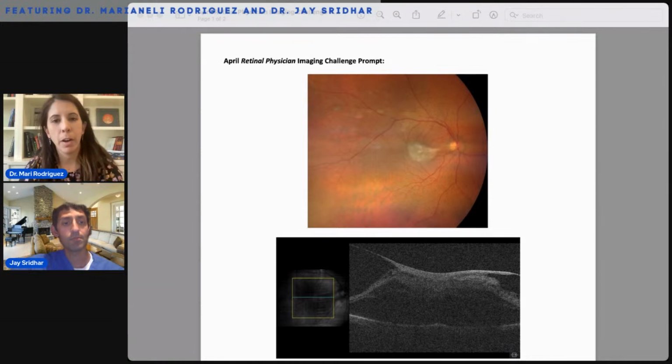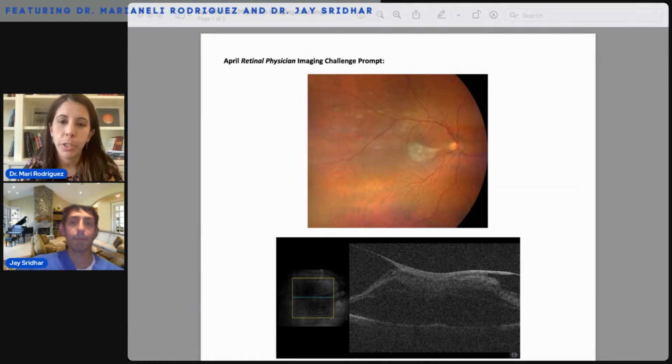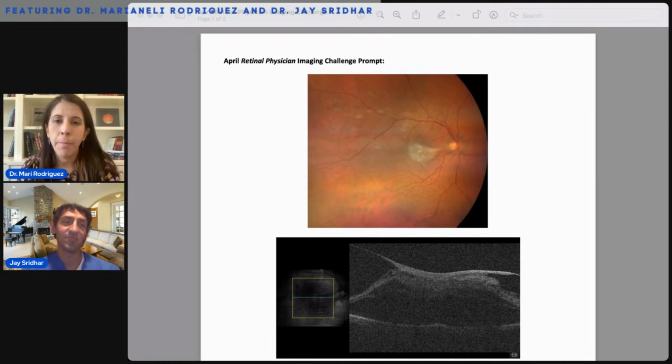And then once you're in the operating room itself, let's say definitely that the hyaloid was down, so I had to induce a PVD. Do you stain? Do you use Triesence to look at the ERM? Do you peel the ILM? What's your approach? That's a great question.